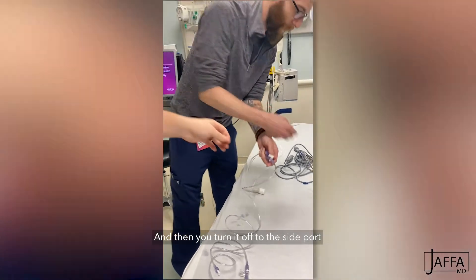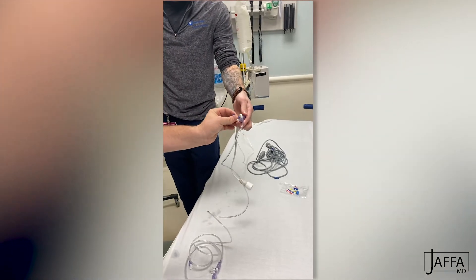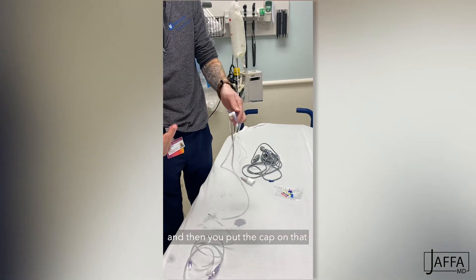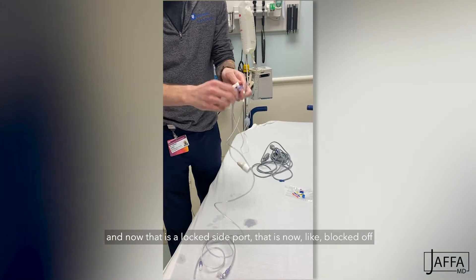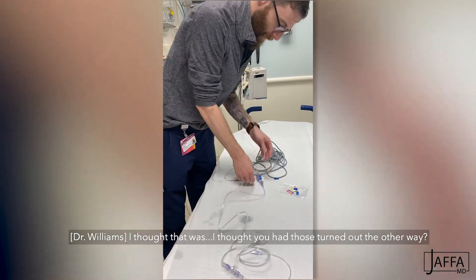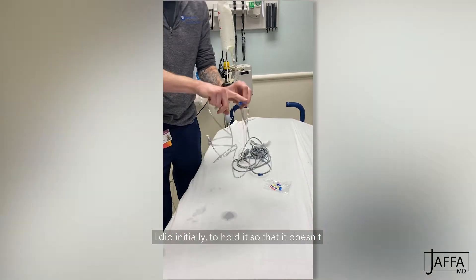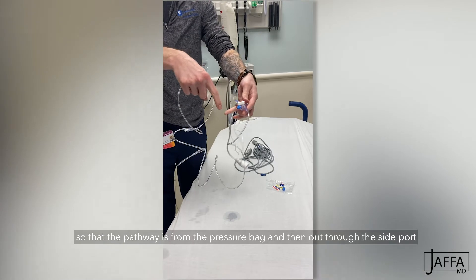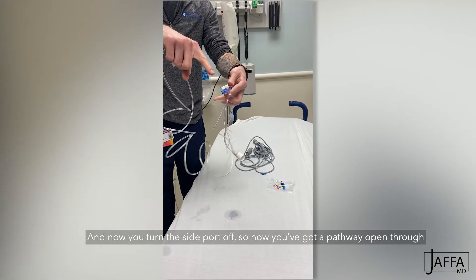Then you turn it off to that side port and put the little cap on that. Now that is a locked side port that is blocked off. I did initially turn it to hold so the pathway is from the pressure bag and out to the side port. And now you turn the side port off, so now you've got a pathway open through.